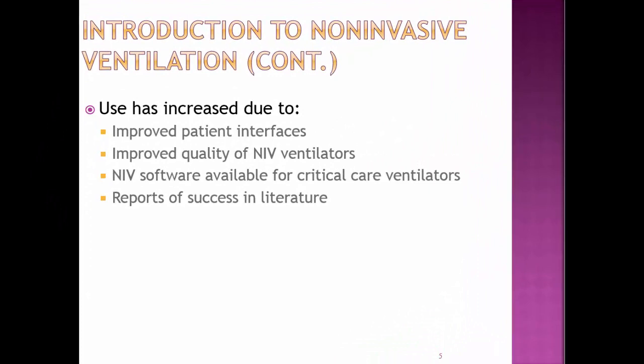Non-invasive is becoming more and more popular all the time, and that's simply because the equipment and the techniques have improved, especially the interfaces, in other words, especially the masks that we wear. The improved quality of the ventilators, and typically you have software available now on your critical care ventilators if you buy that option.